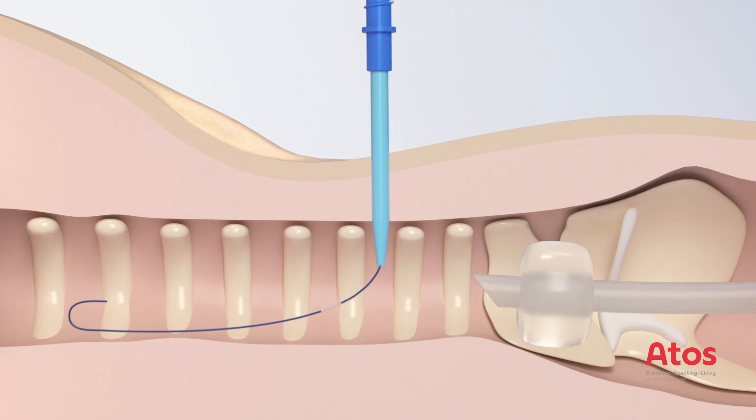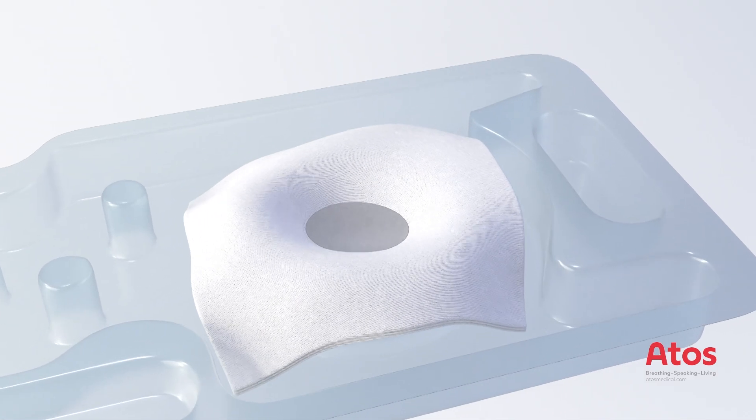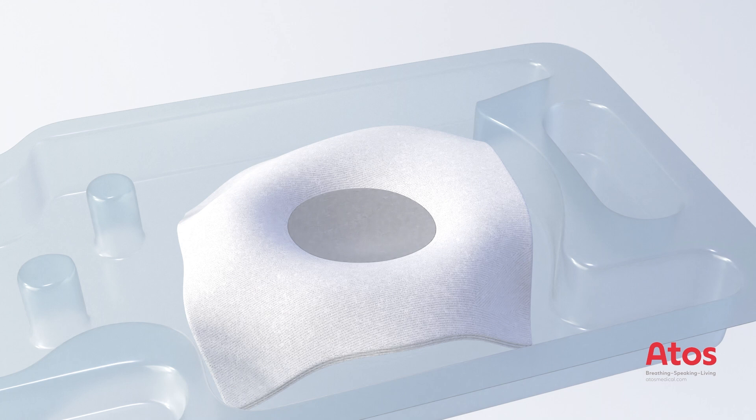Once this is complete, remove the Teflon catheter over the guide wire. Insert the short blue pre-dilator over the guide wire and into the trachea to pre-dilate the puncture site, then remove it while securing the guide wire in place.